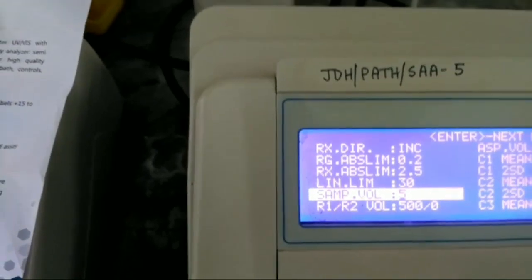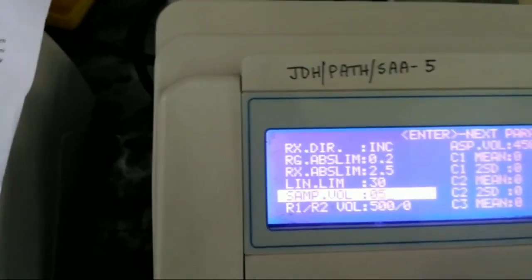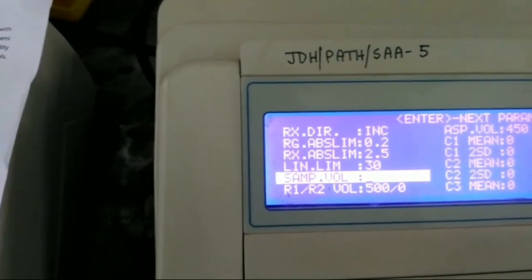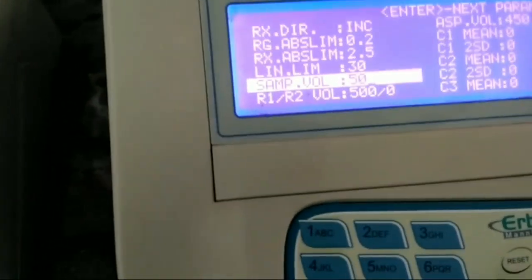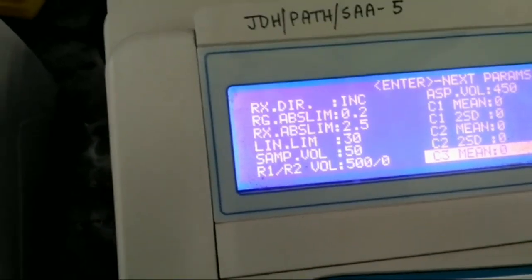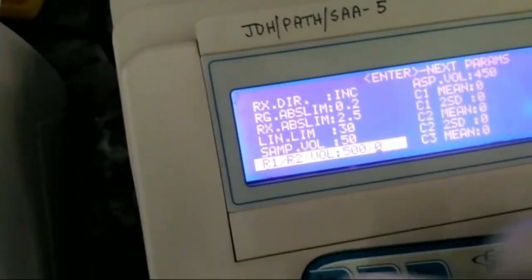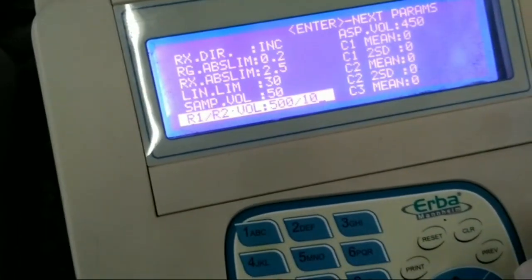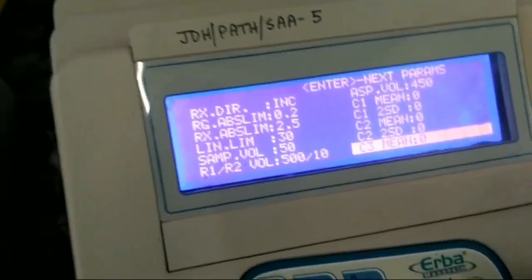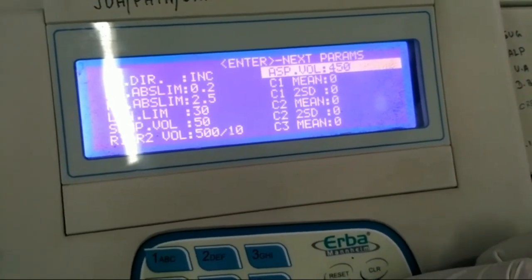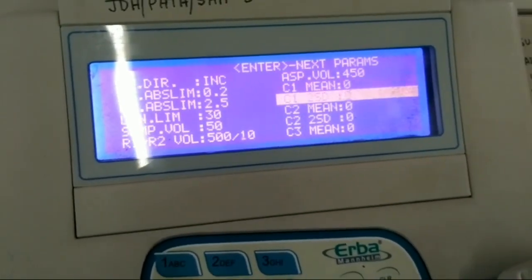The sample volume in this program is 50 microliters, so you have to enter 50. Next is reagent one and reagent two. Reagent one is 500 microliters and reagent two is 12.5 microliters — but we write 10 microliters in the case of reagent two. The aspirate volume is 450 — no need to change.